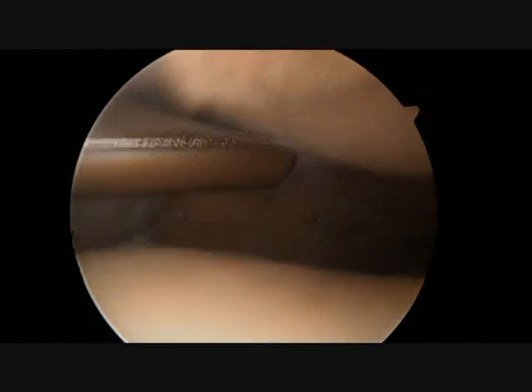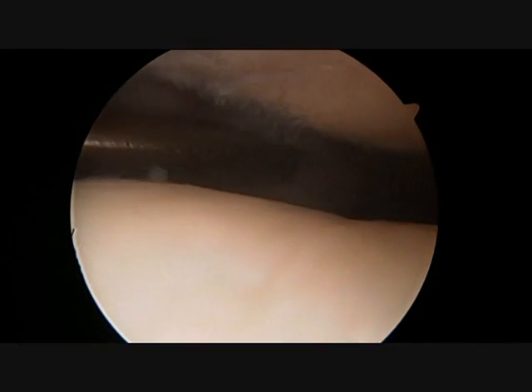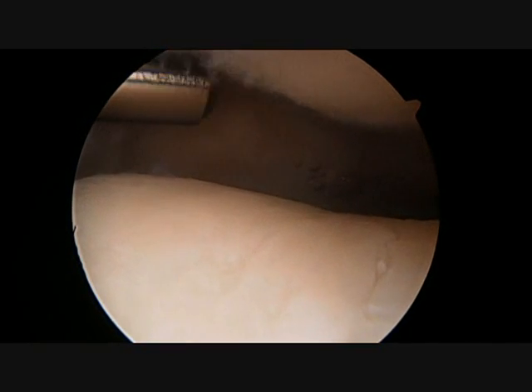The arthroscope initially enters the patellofemoral joint and arthritis can clearly be seen on the lateral side of the patella. The hairy looking cartilage hanging off of the underside of the patella or kneecap clearly shows arthritic changes.